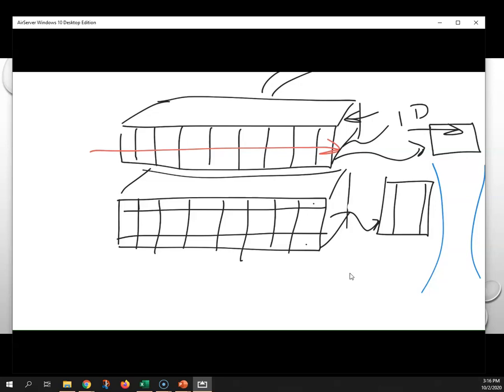And we can do the same thing with this. We can fire off this first, this later, maybe this first. And now we can steer, we get the same effect. The wavelets come out and they're focused in the elevational plane. So now we're getting an elevational focused image. So it not only focuses in the lateral plane this way, but it focuses in the elevational plane. Alright, so that's a 1.5 dimensional array probe.